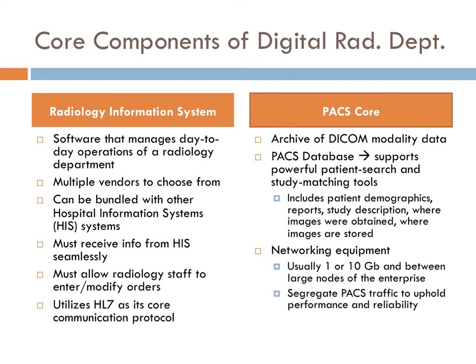A radiology information system is one of the core components of a digital radiology department. It is called the RIS. It is software that manages the day-to-day operations of a radiology department. There are essentially hundreds of vendors to choose from out there that have different RIS systems to sell to hospitals.